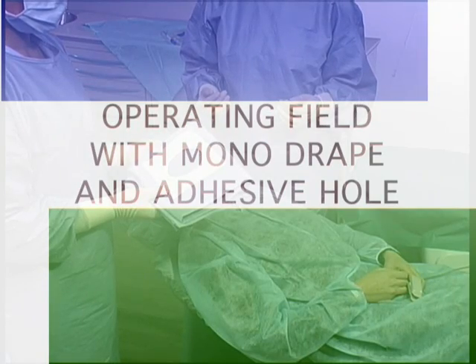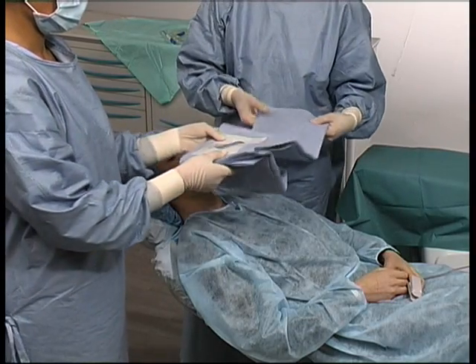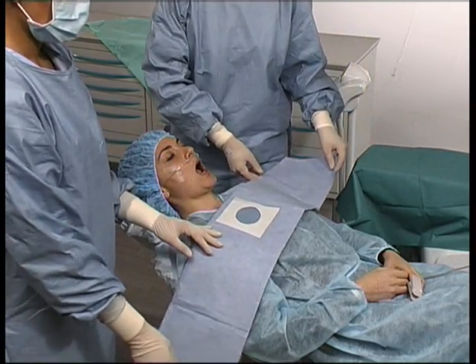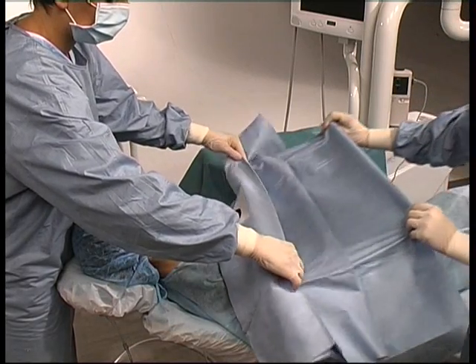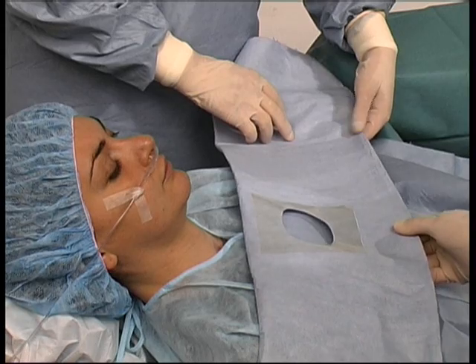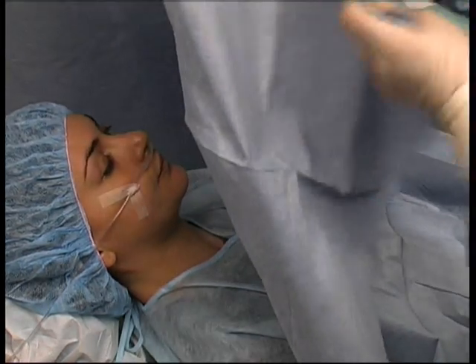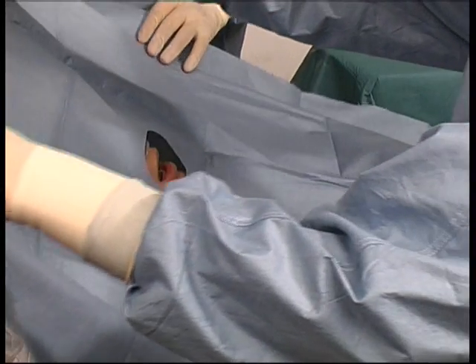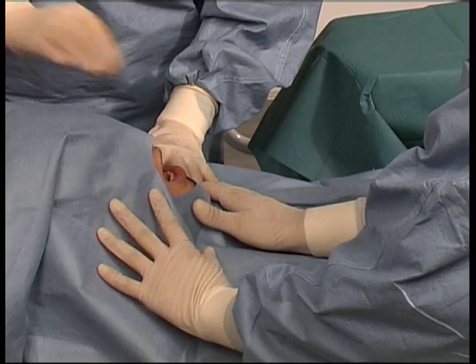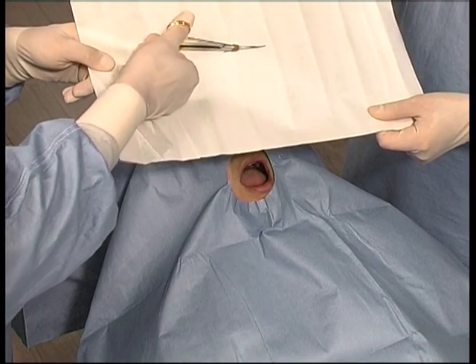Operating field using monodrape and adhesive hole. The drape is placed over the patient's chest and unfolded towards his feet. In this case, the patient must be attached to a suitable oxygenation and monitoring system. The protective strips are removed from the adhesive and the drape is fixed over the face. The sterile field can be integrated using a transparent incision drape.